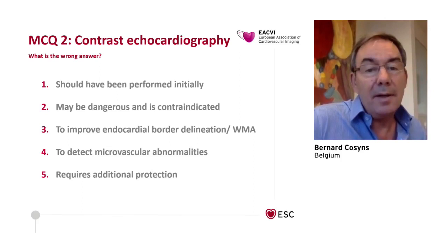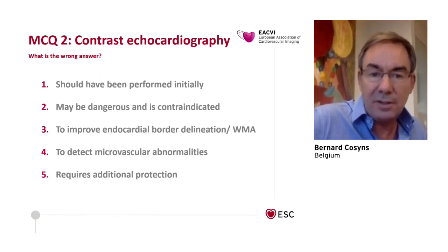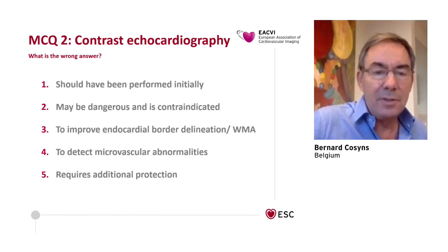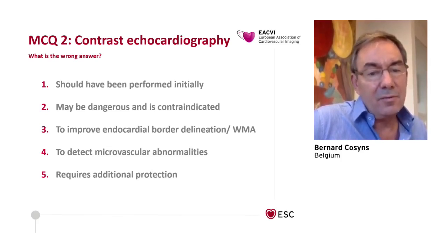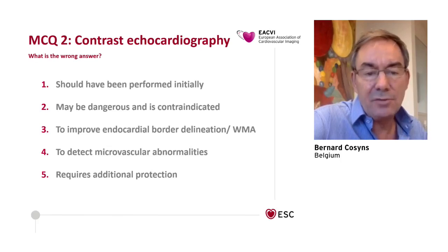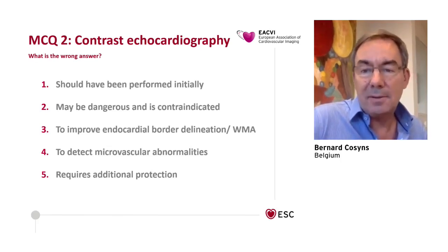So I remind you that in this patient, the quality of the transthoracic echo was far from optimal. This patient is critically ill, so he was requiring some oxygen support, non-invasively, but still. And of course, this patient had normal epicardial arteries after the aspiration of the thrombus. I don't know if you have already some answer, Andreas. Oh, we have only a few seconds. I think we have the answers now, yes. The majority of our audience prefers answer B, may be dangerous and is contraindicated. So, yeah, I think it's a very good answer.